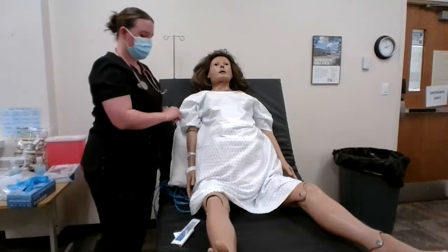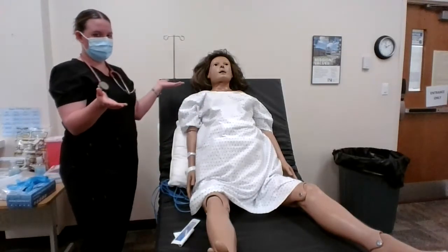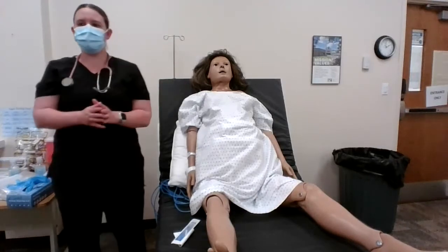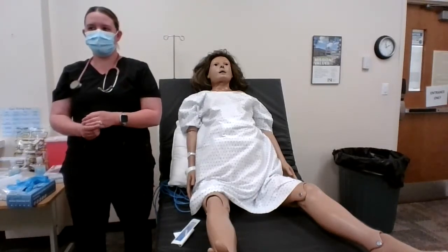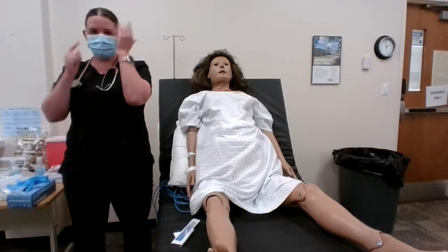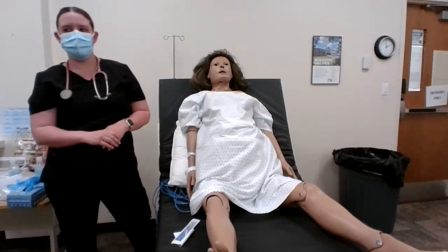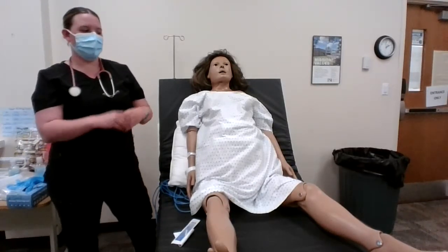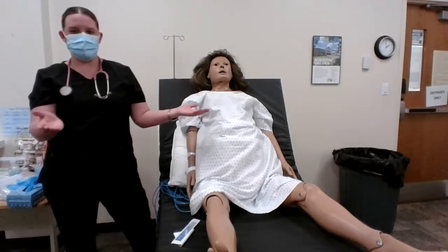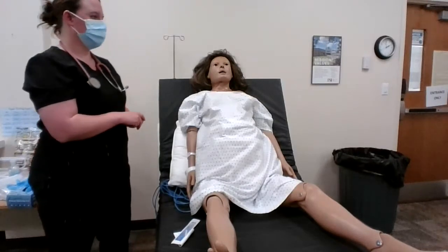Assess visual acuity with a Snellen chart. You will have your patient stand up out of bed 20 feet away from the Snellen chart. Ask them to read the smallest line of letters possible, first with both eyes, and then with one eye at a time. Note whether the patient's vision is being tested with or without corrective lenses. So you will have your partner stand up and actually perform this on the Snellen chart. Remove glasses if the patient is wearing them.